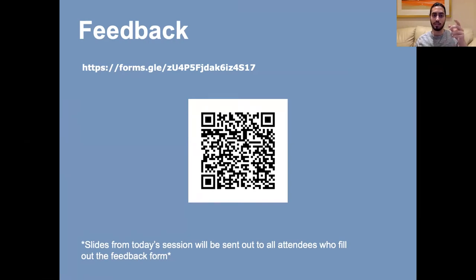Those are contiguous leads, meaning if you've got changes in those leads, in those territories, if you've got two or more changes, then you can diagnose things like MI. But you basically got to look in each territory to find out where the problem is, and so you can isolate the problem, and that's what contiguous leads means basically.